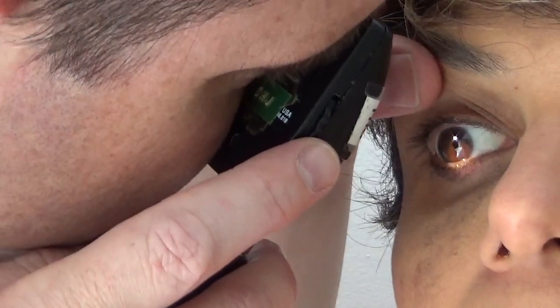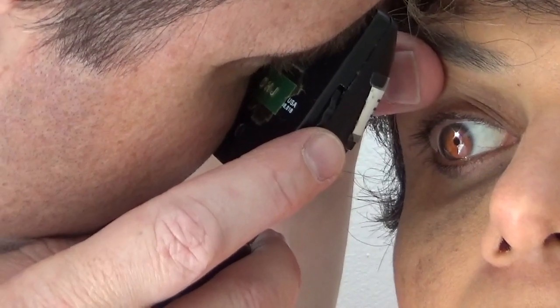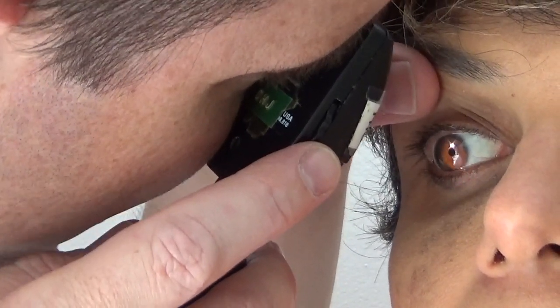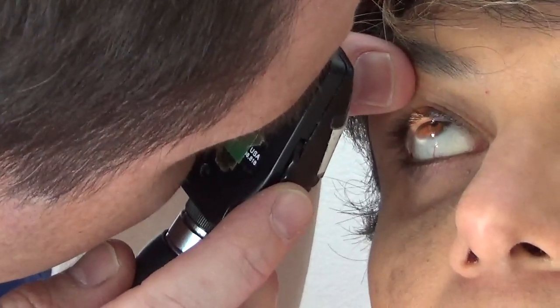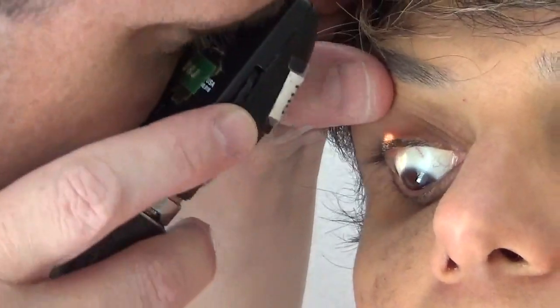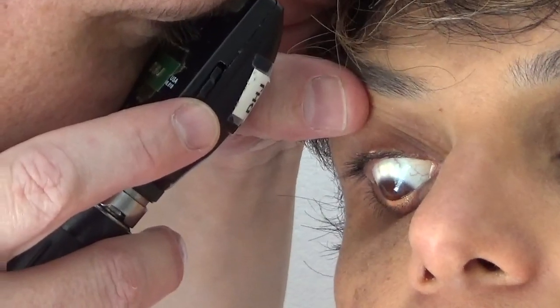Then, once you are looking at the optic nerve, you are able to get the patient to look up such that you can see the superior retina, and down to visualize the inferior retina, left to see the nasal and right to see the temporal retina.